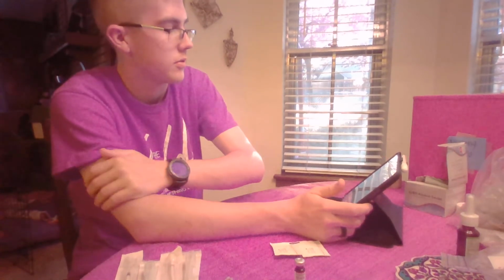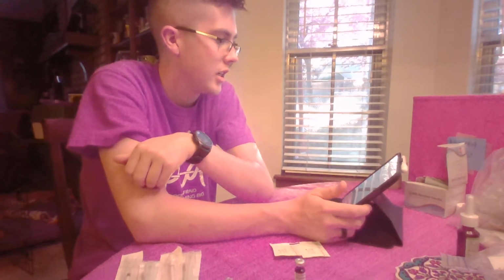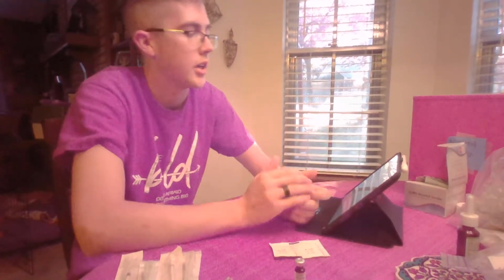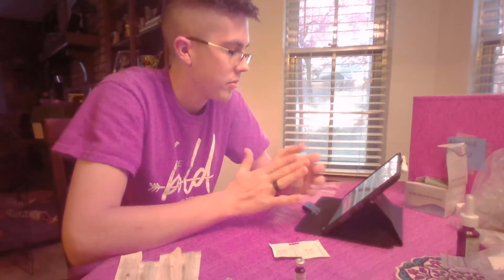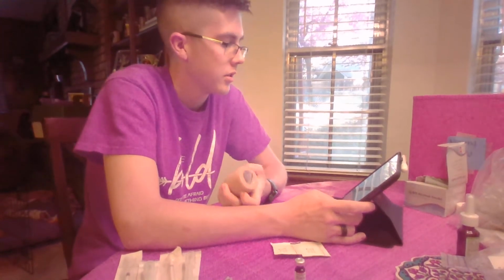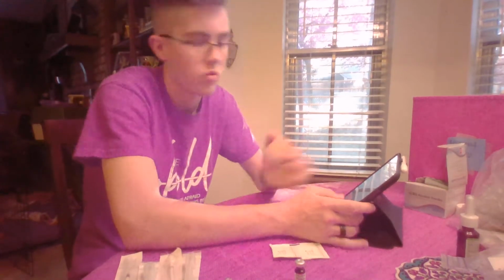So starting off, I need to be assuring that my patient is being ventilated adequately if necessary. If my patient is alert, I can ask them if they have any known allergies. Clearly explain procedures to the patient, medication, find my materials, alcohol swabs, sterile gauze.